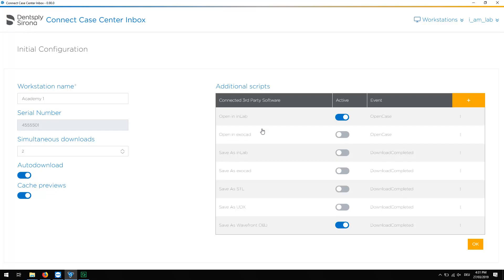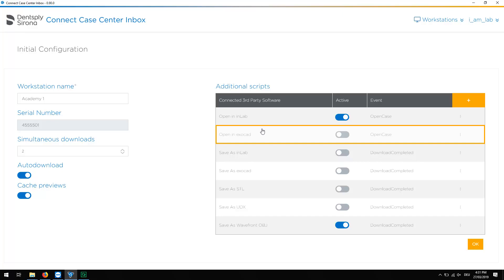As an alternative, the received data can be opened with the ExoCAD software version 2.3 or higher when the second script is enabled. This is a validated process, and the received 3D data are reformatted to ExoCAD data.